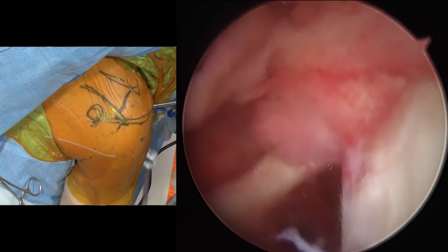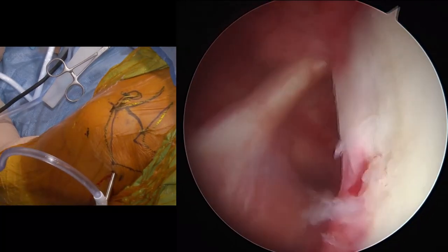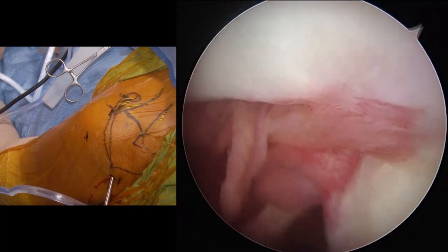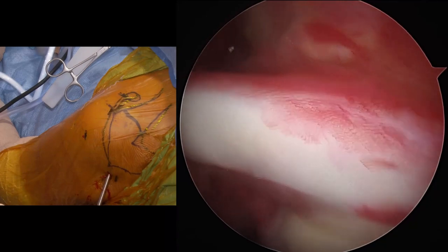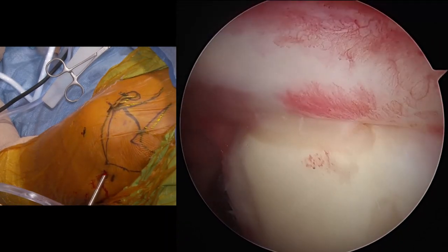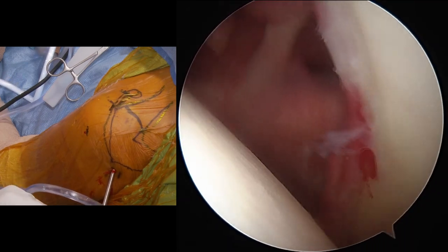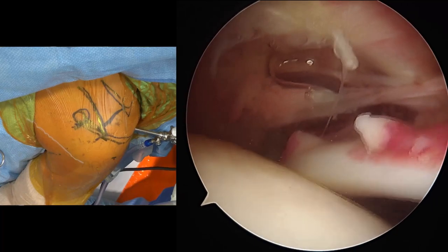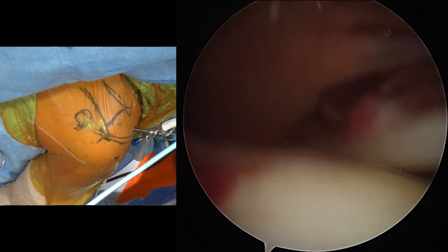So he's got a fair amount of joint fluid. We'll make sure we can see well here. As we look to the front of his shoulder, we'll back up until we see the biceps tendon, which is our lighthouse. We see a fair amount of inflammation over the top of the biceps, some irritation of the labrum. We see a cord-like middle glenohumeral ligament up front. And as we look out laterally to see if there's an injury to the rotator cuff, there's a significant elevation here. We're going to take a closer look at this.